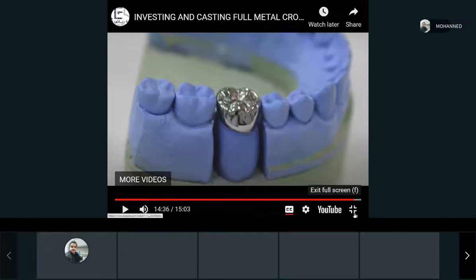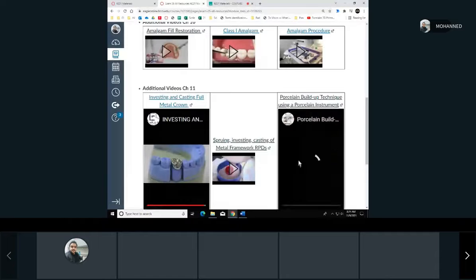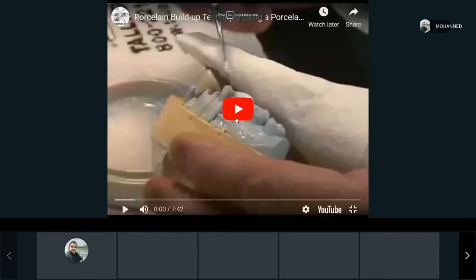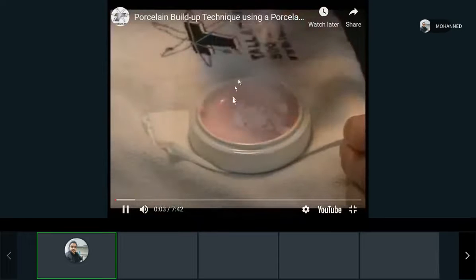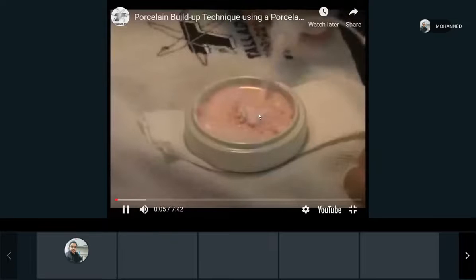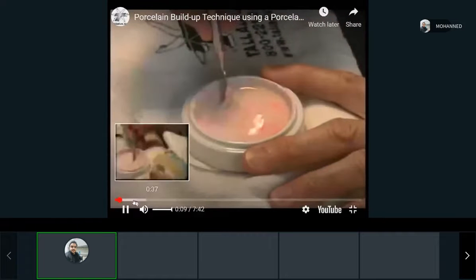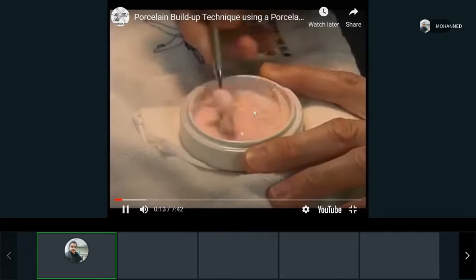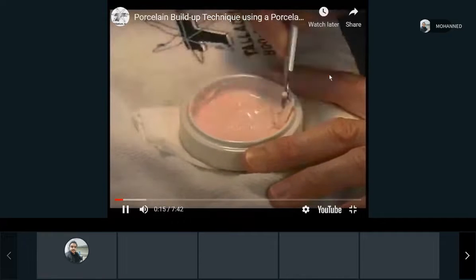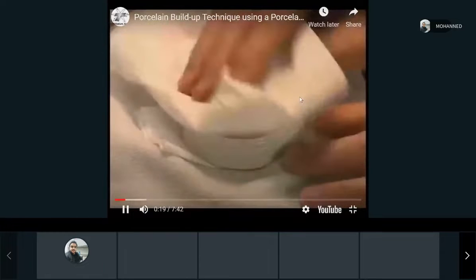Let me see if I have something to show you. So this is porcelain. This is how they build porcelain crowns. And this is the porcelain material. They mix it up and the lab technician will start building it up. I just want to see if they have that metal part that is on the tooth that we call coping.